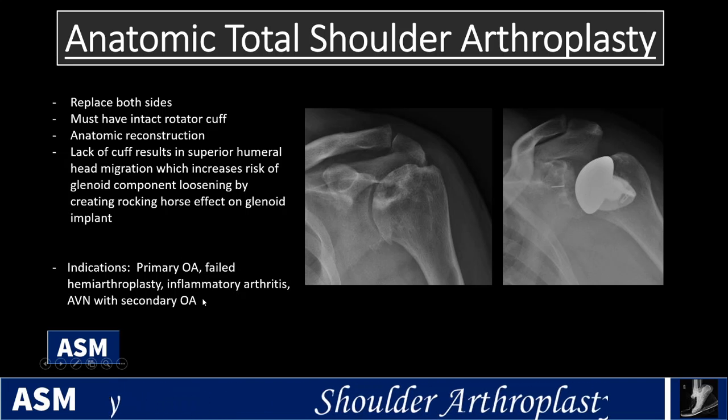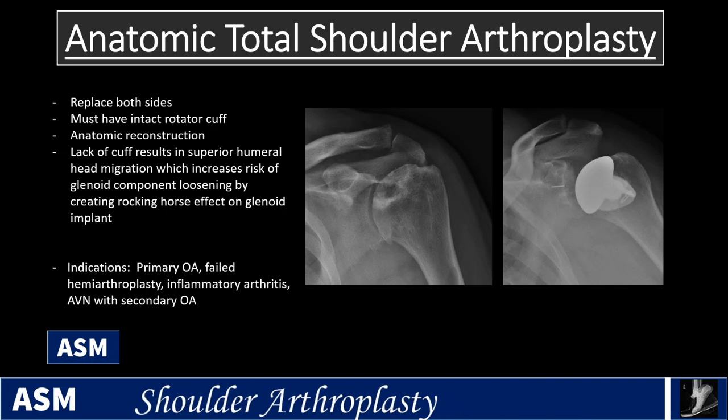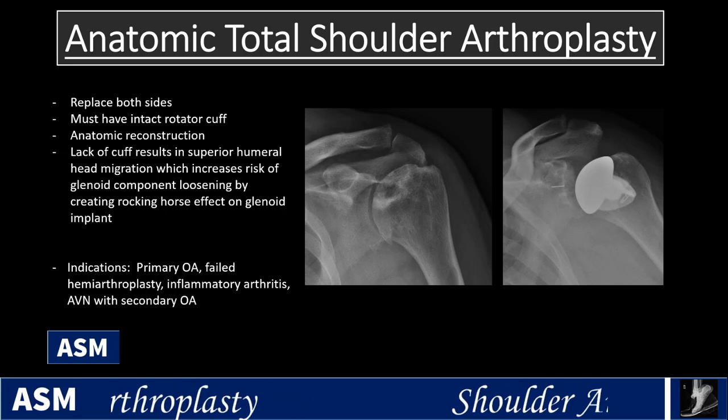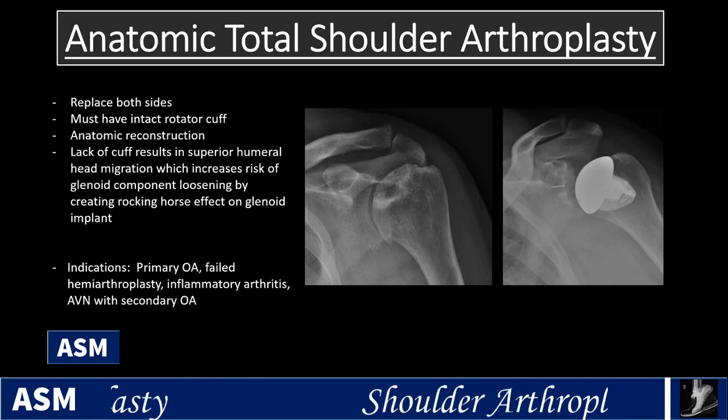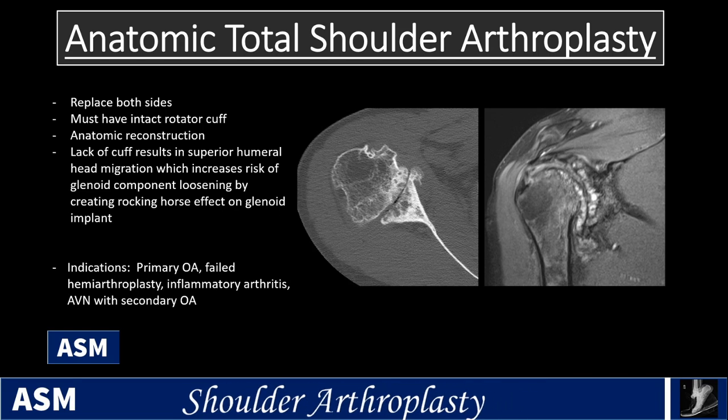but you can see there's a series of other indications here, and there is some overlap and surgeon preference and things related to patient factors that may push the surgeon to either go towards anatomic or reverse. So there is overlap, and it's worth noting that.